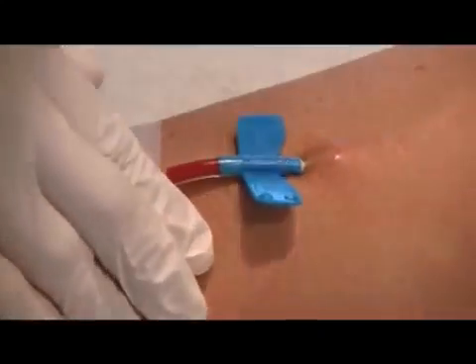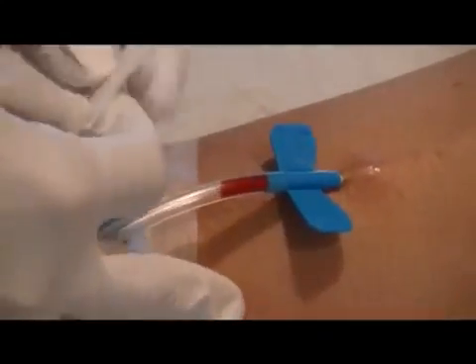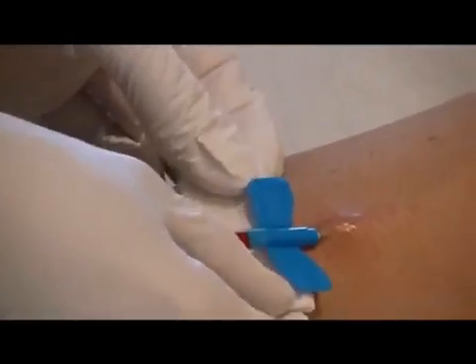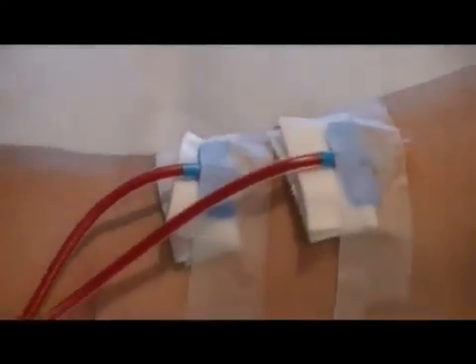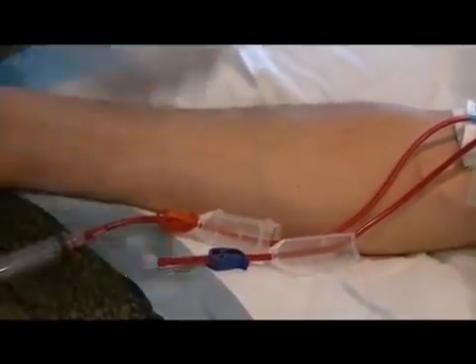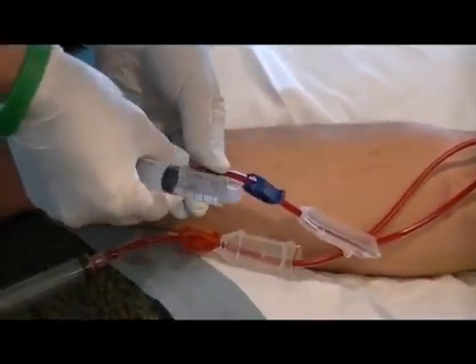You always advance it all the way in so that it doesn't bleed around it. And I always put these little gauze pieces underneath it just to prop it up a little bit so that it's not on the wall of the vein in there. Tape it once. Make sure you've got good return here. Same thing with the saline flush, and then we'll actually put the heparin in this one as well.